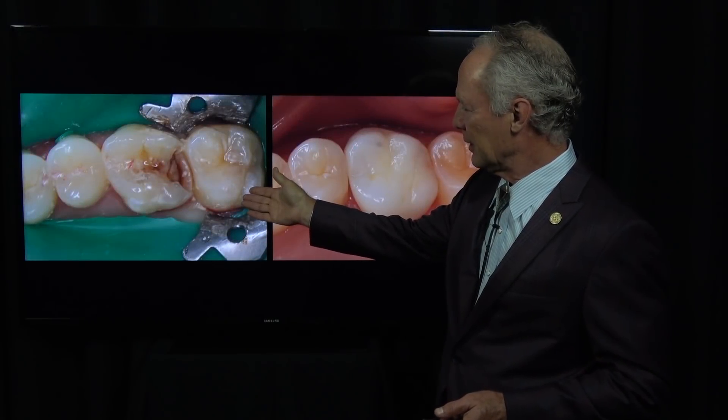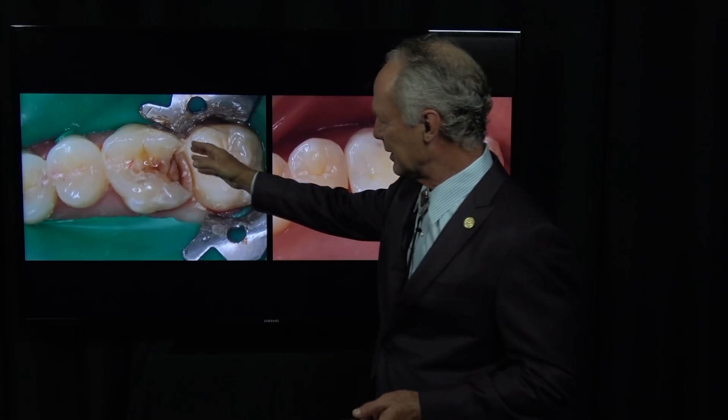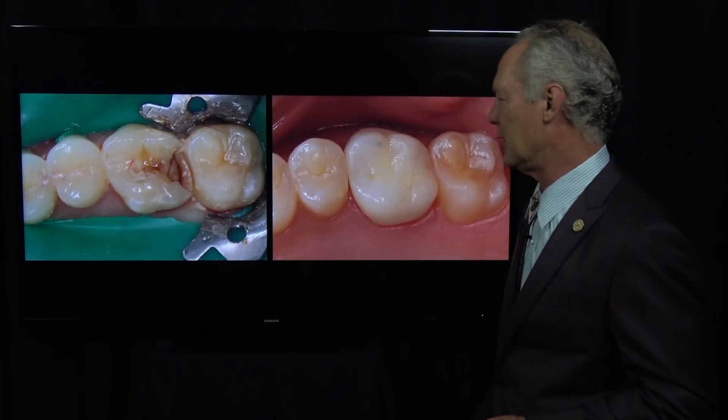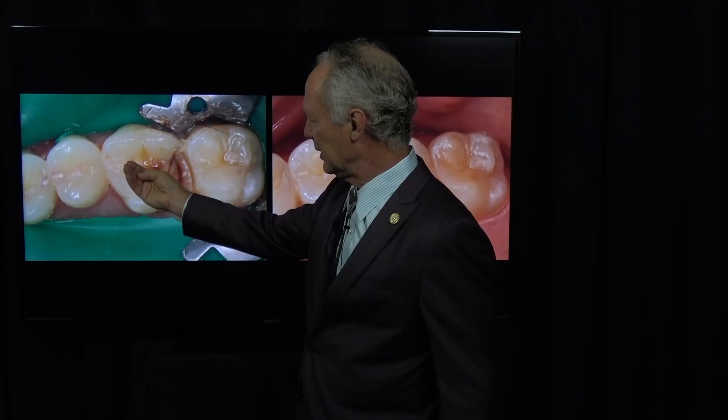This young woman presented with this tooth — you can see the decay and all the tooth structure that's gone. I saw a new patient yesterday where the entire inner part of the tooth was eaten away on a cuspid, and I suggested that we extract the tooth and place an implant.